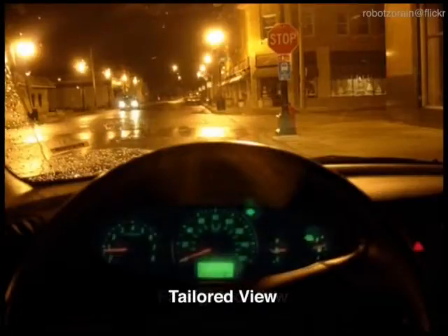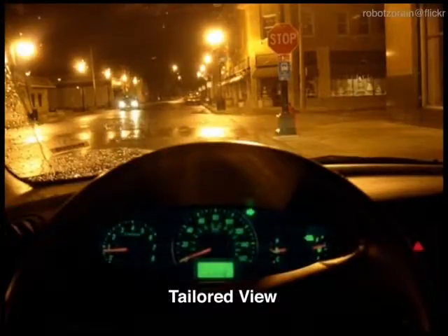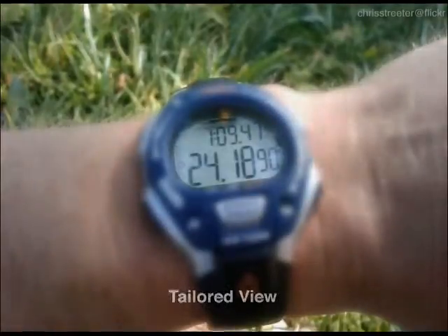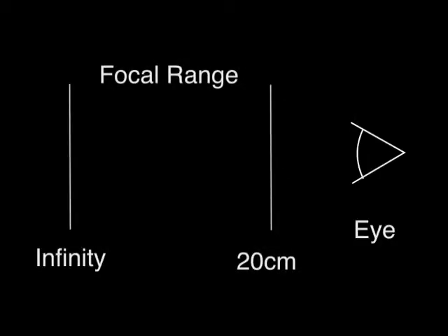We propose a novel display technology which adjusts itself to compensate for visual aberrations. The goal is to improve an individual's visual acuity without the need for eyeglasses or contact lenses. Tailored displays, as we are calling them, transfer the displaying information to the focal range of an individual.